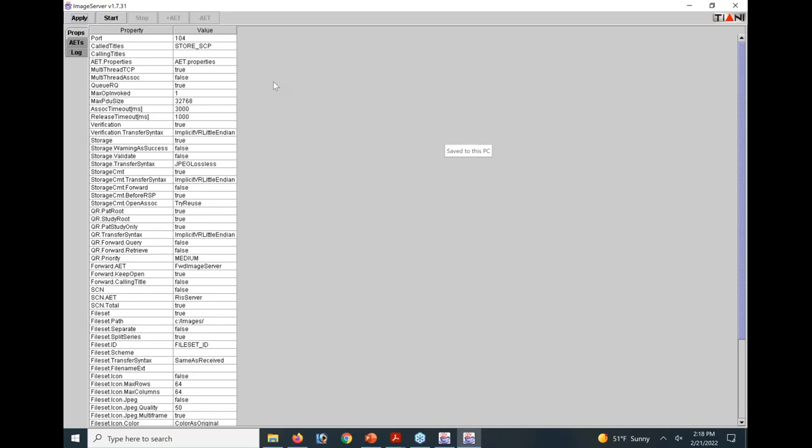Can anybody see that far? Yep. What's the top field asking for? Port number. The second one is what you are, your called title. Yeah. So that's an AE title. So with AE titles, there's always a called and a calling. Which one's the SCP?